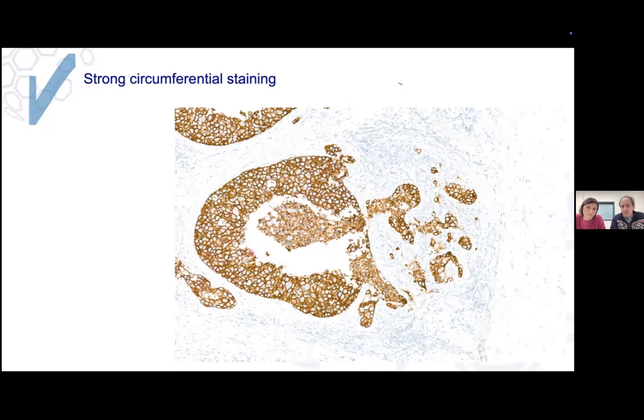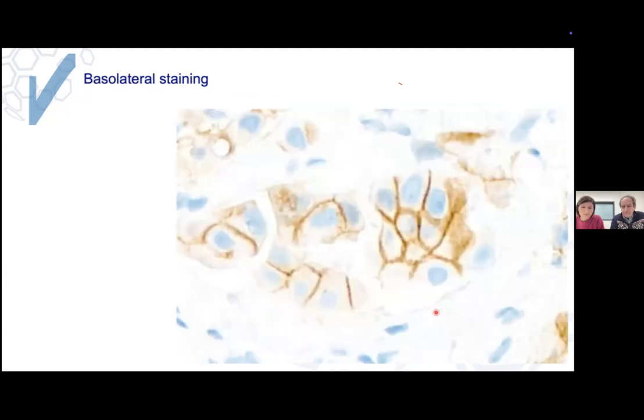We couldn't care less because this is DCIS, but I would like to show this picture because you see here these little early invasive tumor cells coming out, spinning off the DCIS. So strong, continuous, diffuse, nice. And that's also the hallmark of the greatest majority of HER2 amplified tumors, because it's an early event. There are some that are very patchy, but they are more rare.